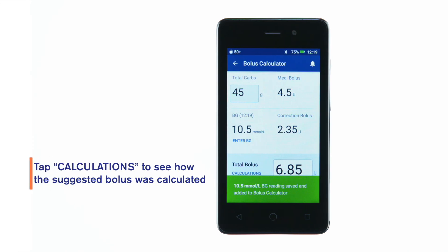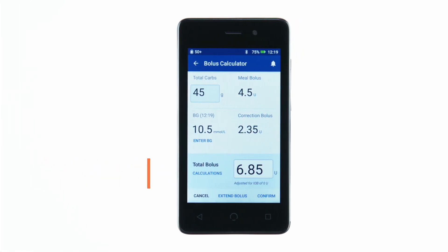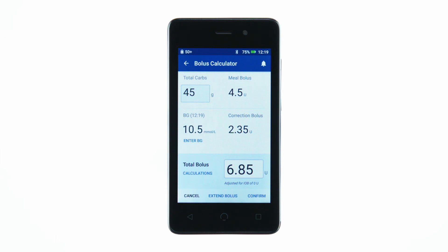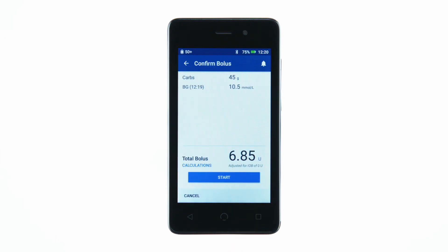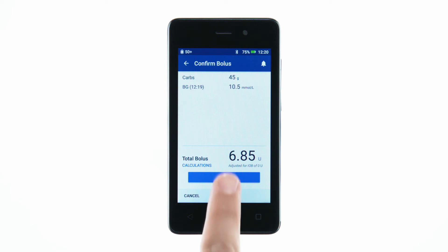Review the suggested meal and correction boluses to the right of each value. Tap Confirm. Review the bolus details on the Confirm Bolus screen, then tap Start to begin the bolus.